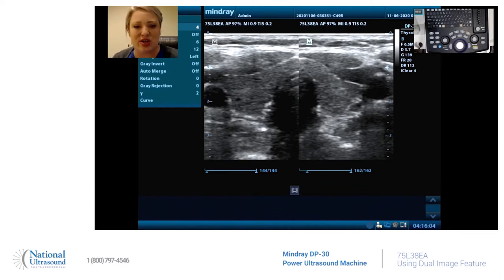As you can see on the screen, I use a linear probe and it's a picture of my thyroid. Some thyroids, as you all know as sonographers, can't always fit on one screen. So dual image can be your best friend.